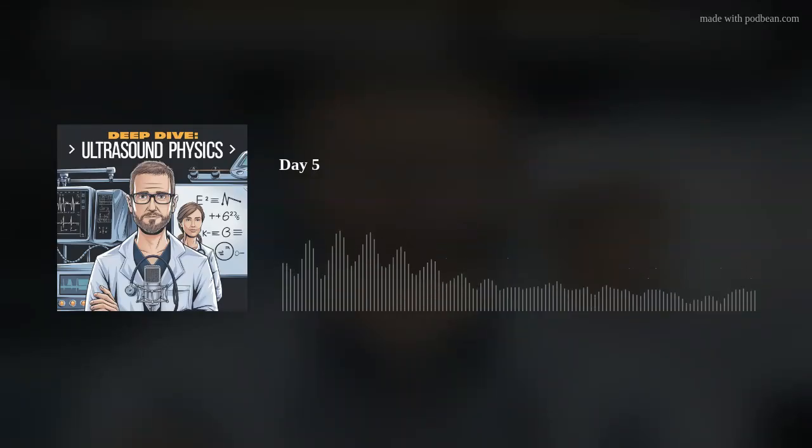Right. Now, pulsed wave is great for pinpointing flow at one spot. But sometimes you need the bigger picture, right? Like flow across a whole vessel. That's where color flow Doppler comes in. How does that work? How does it build on this? And what's its main advantage? Well, color flow Doppler is super important for exactly that, visualizing the overall blood flow patterns. You see it used everywhere. It uses the same basic Doppler principles, but instead of just the spectral graph for one point, it processes the Doppler shifts across a whole area and displays them as a color map.